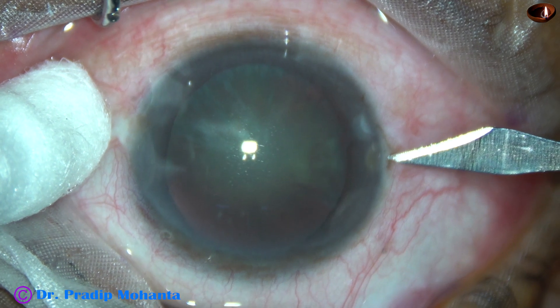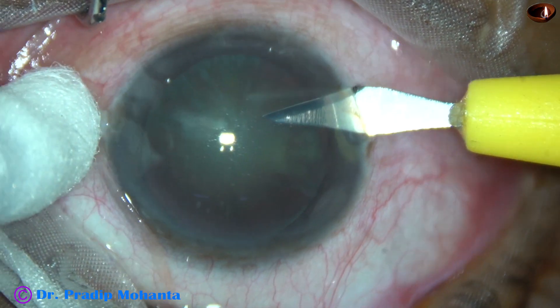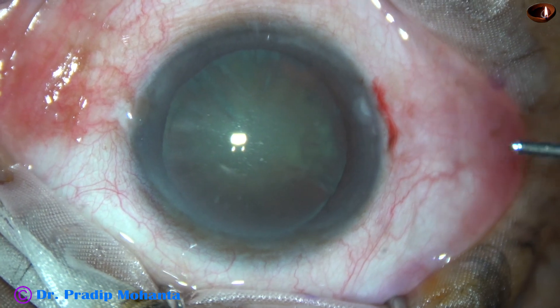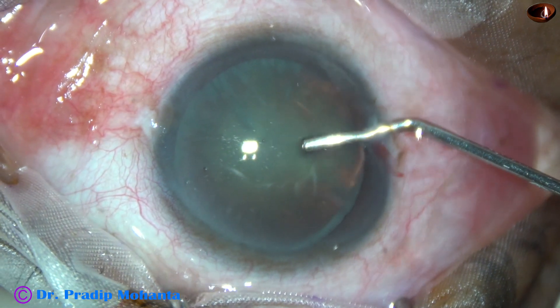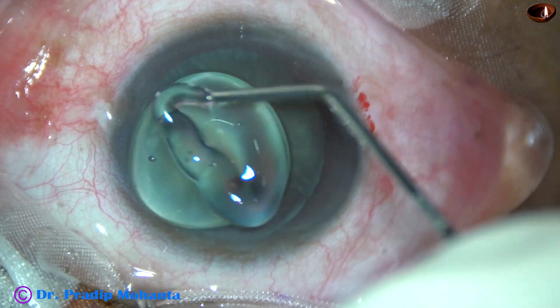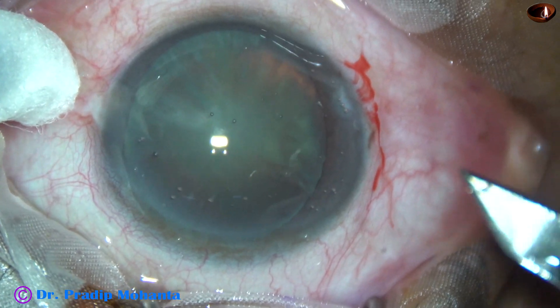First, make the side port on the right side of the main incision at around 8:45 o'clock, and make the incision from just behind the limbus. Don't make a very small side port; the width of the side port may be 1.6 or 1.7 mm.